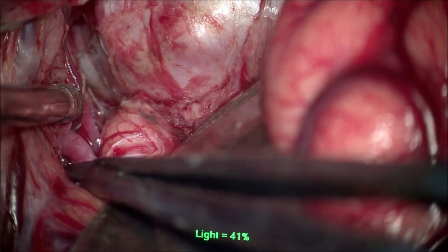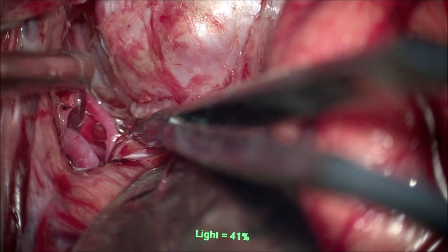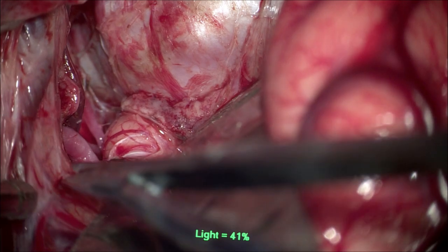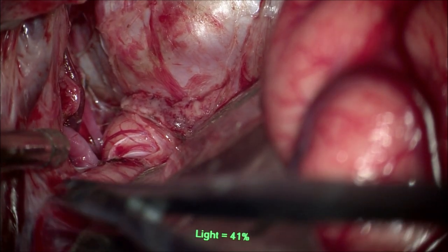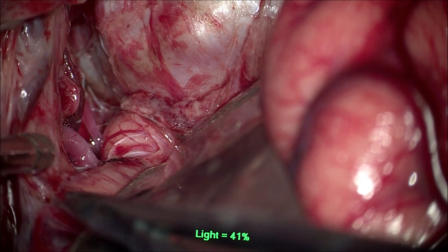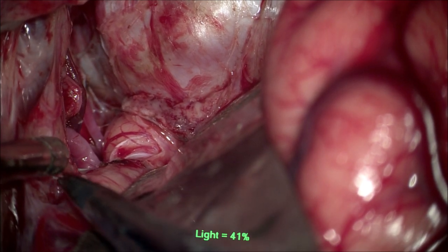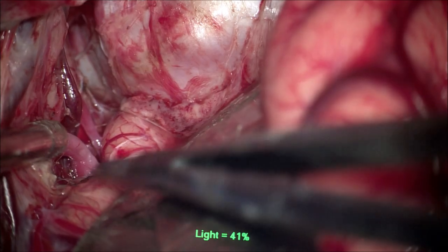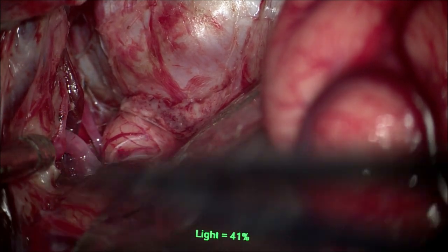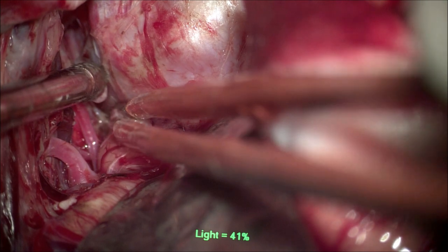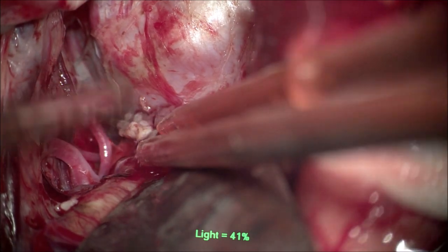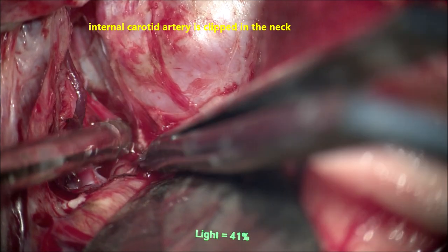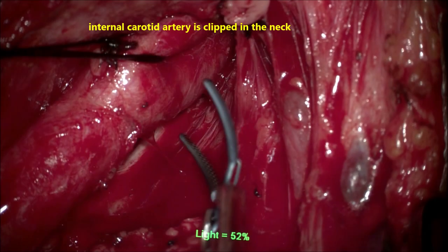Now at the deeper and medial part of the sylvian fissure, the internal carotid artery is seen on the surface of the dome of the aneurysm medially, but the rest of the branches are not yet seen. Opening the fissure wide helps reduce retraction of the frontal and temporal lobes, which is of great importance here because the brain is already tight and swollen — likely due to ischemia produced by the giant aneurysm with multiple thrombus.